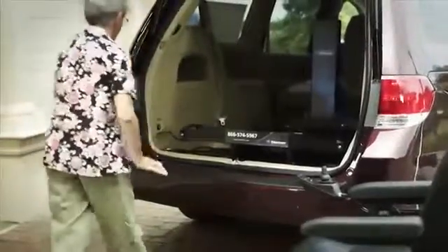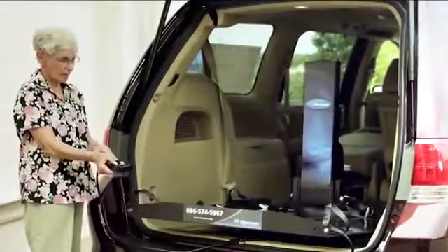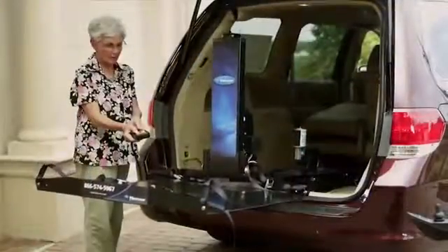Her Harmar AL600 Hybrid Platform Lift allows her to load her scooter or power chair inside the vehicle. Harmar lifts are simpler, stronger, lighter, and easier to use.